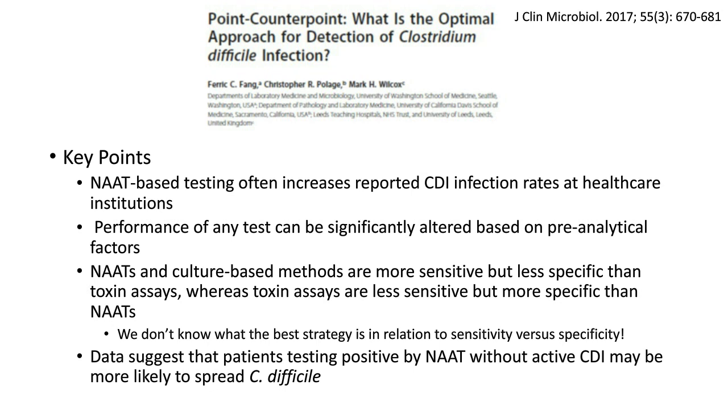What both sides ultimately agreed upon was several points. The first point that they primarily agreed upon was that NAT-based testing often increases reporting of Clostridium difficile infection rates at healthcare institutions. And this is not particularly surprising. Use a more sensitive test, and you're more likely to find more cases.